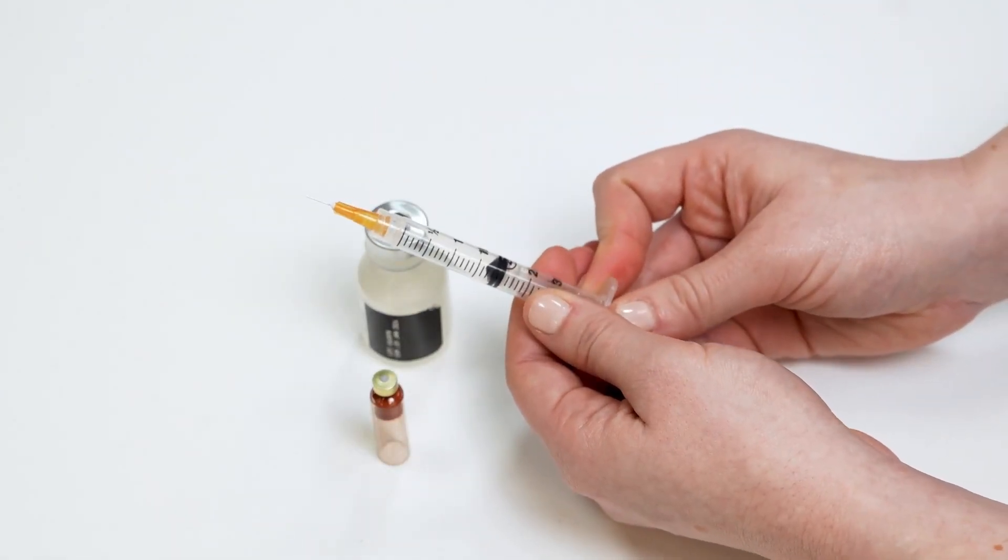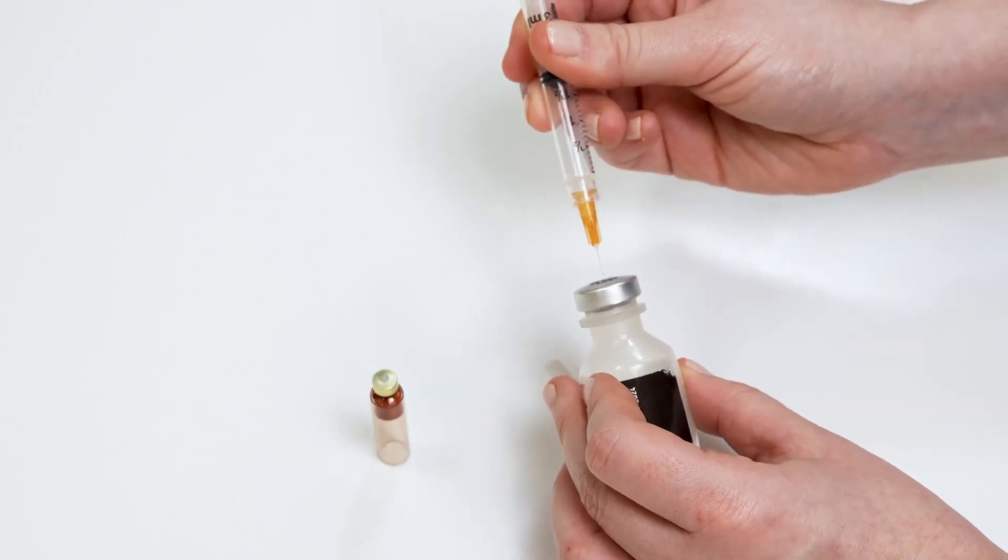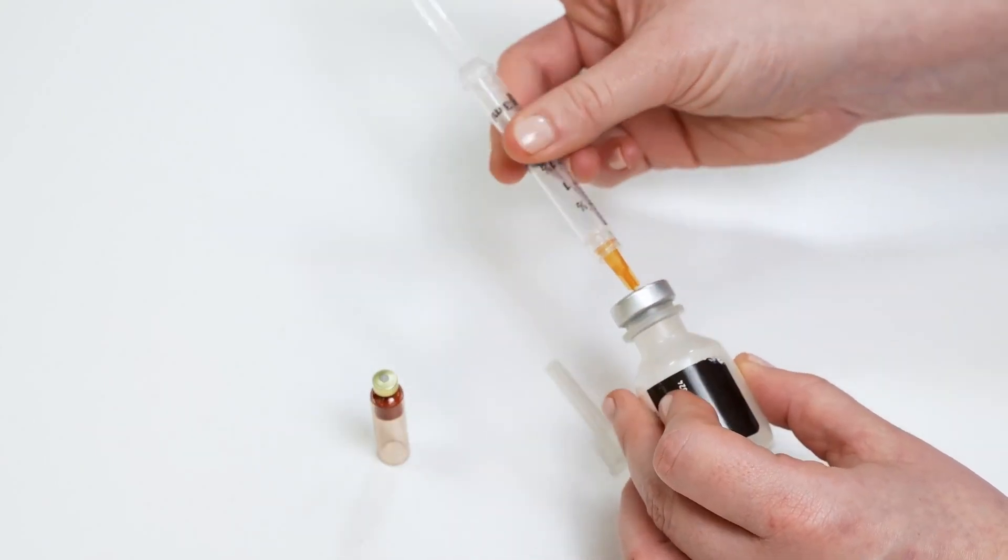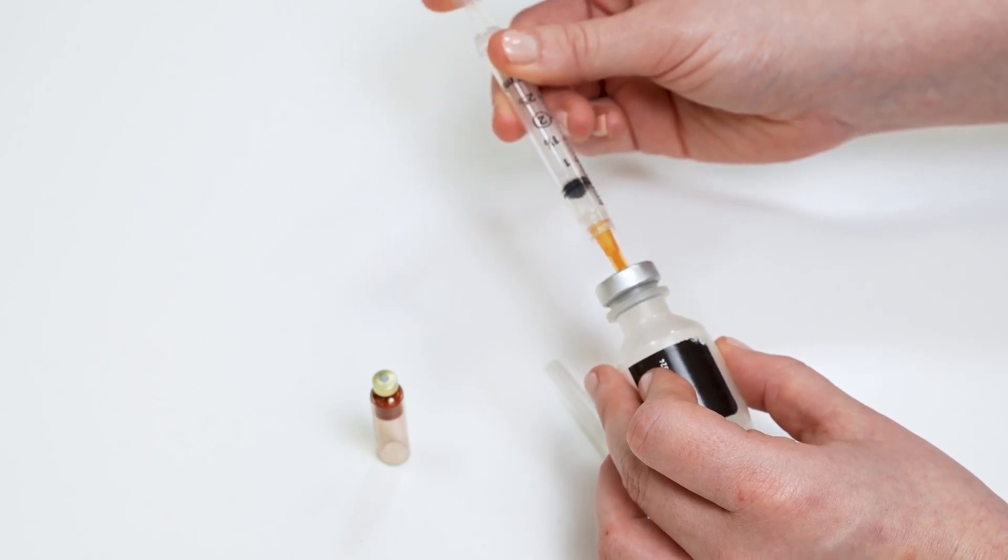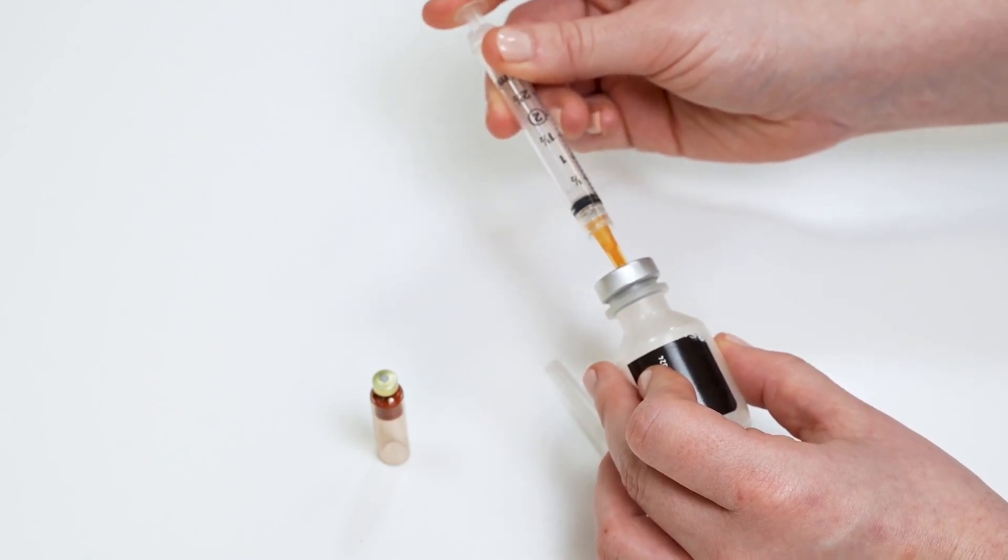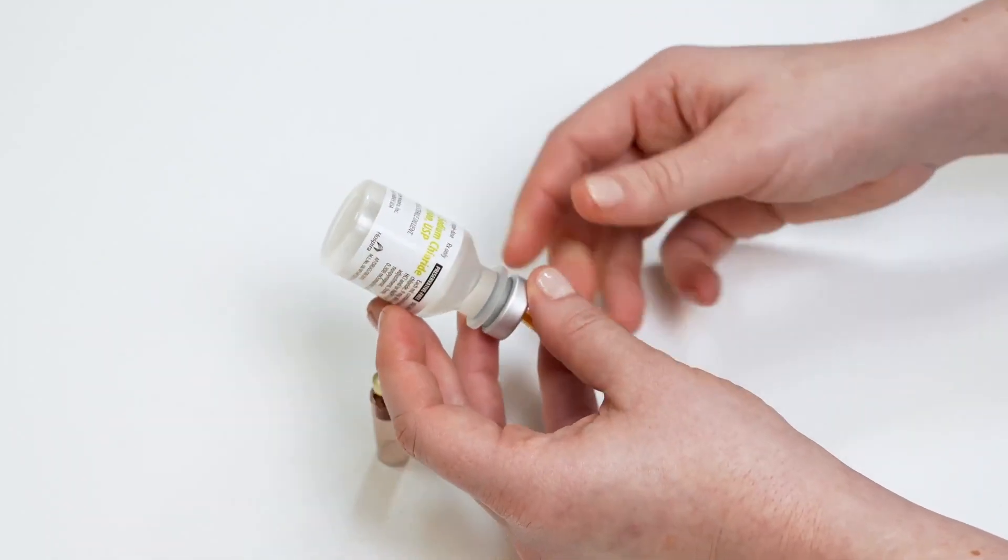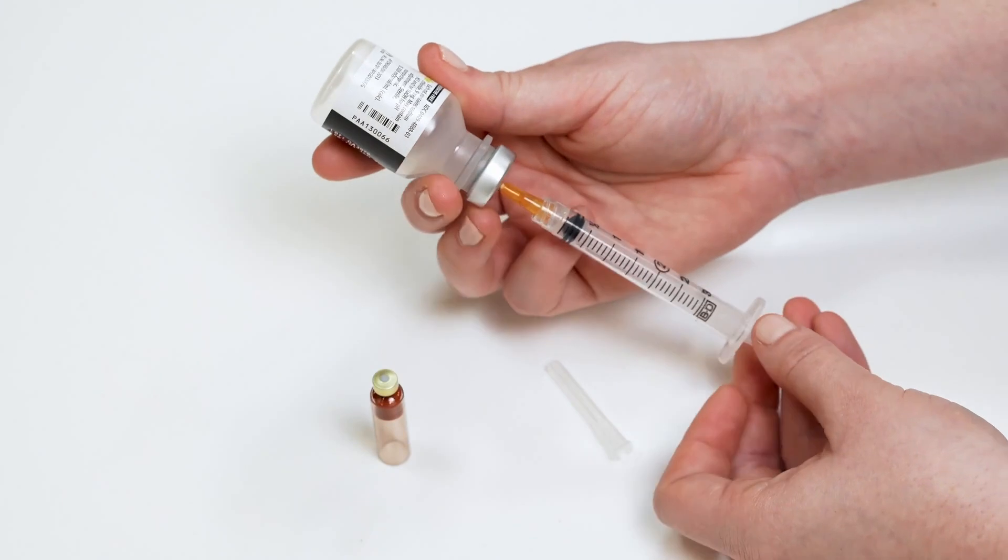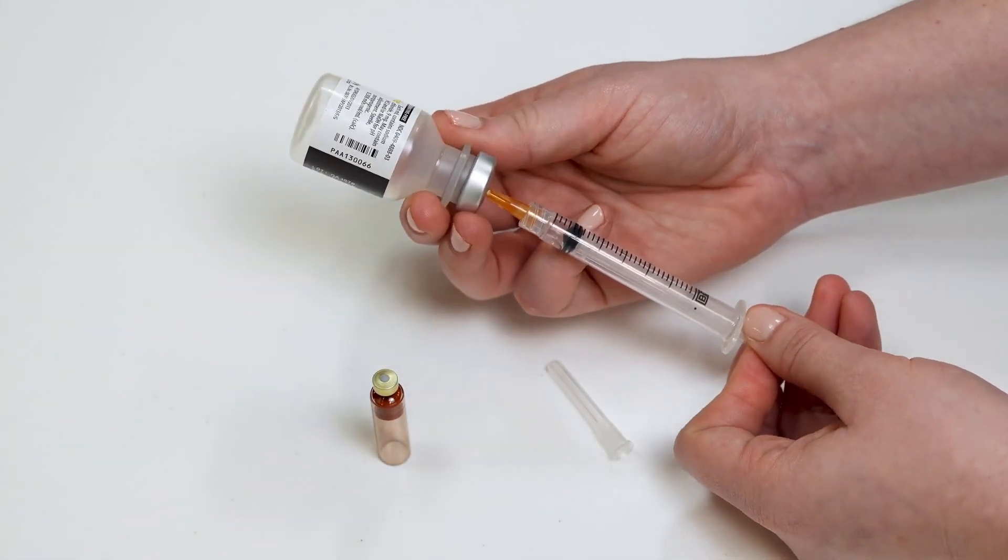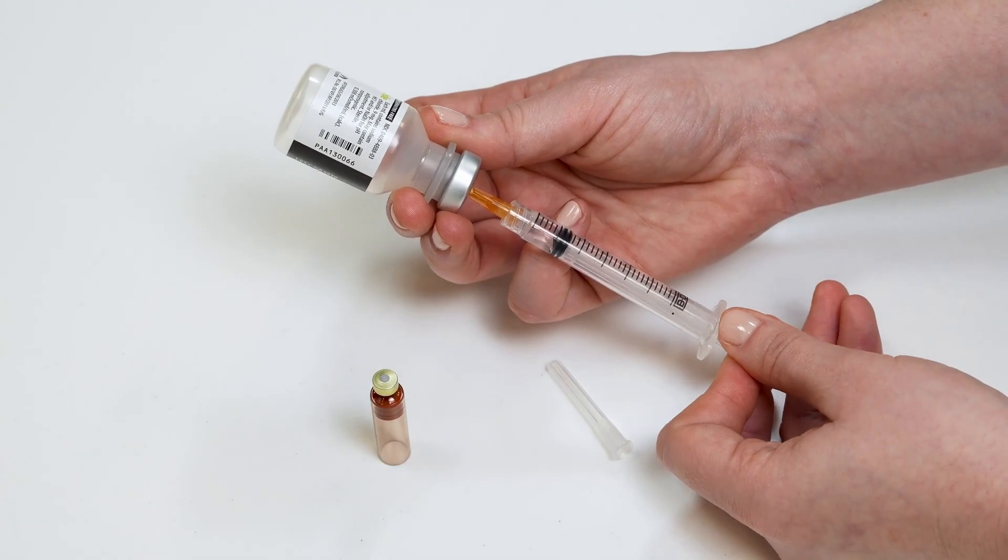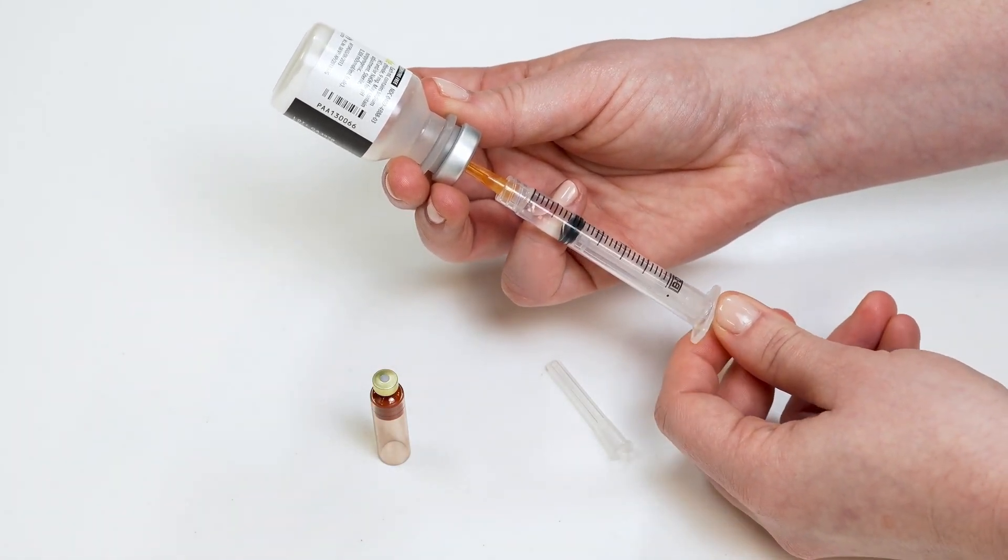Insert the syringe into the insulin vial. Push down the syringe plunger rod to fill the vial with the air from the syringe. Keeping the syringe in the vial, carefully and slowly invert the insulin vial and syringe. Pull back on the syringe plunger rod to fill the syringe with about 1.8 ml of insulin.